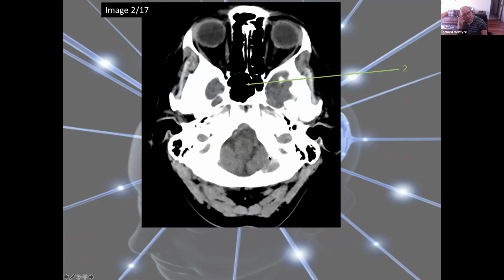Go up a little bit higher. Now this sinus is just in front of the pituitary, and doctors use this sphenoid sinus to go through to the pituitary. External ear canal, mastoid cells. What hemisphere is that? It's the left cerebellar hemisphere, or it's just the cerebellum. Yep, we know that. That's too easy.